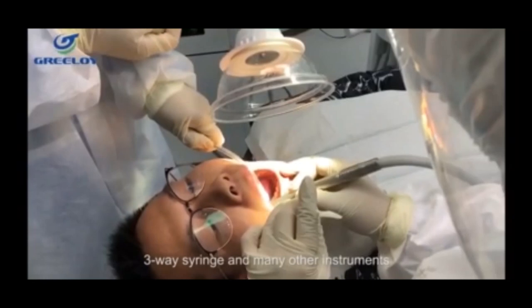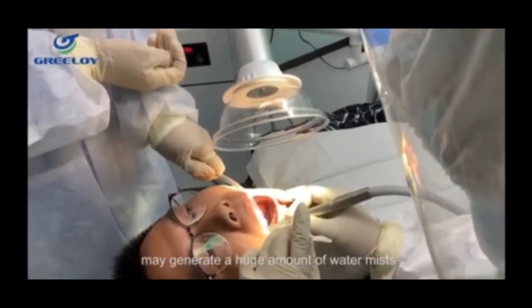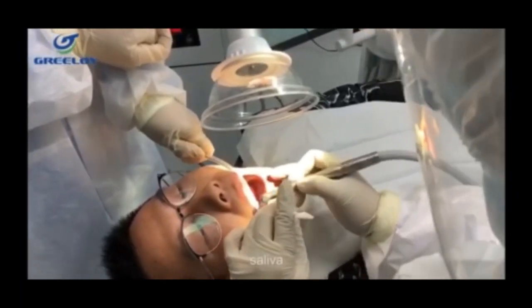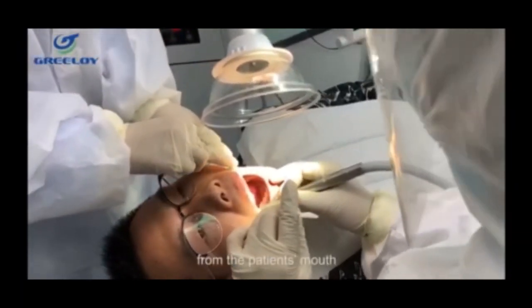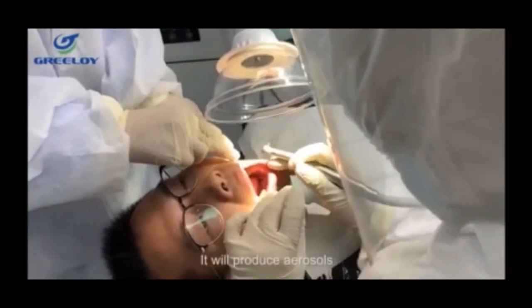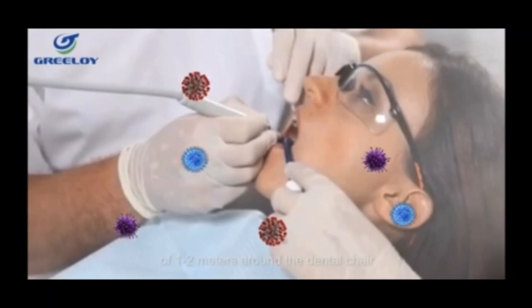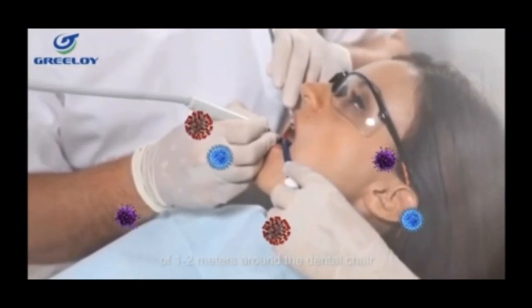three-way syringes and many other instruments that may generate a huge amount of water mist combined with bacteria, saliva, blood and debris from the patient's mouth. This produces aerosols which last for a long time within the range of 1 to 2 meters around the dental chair.